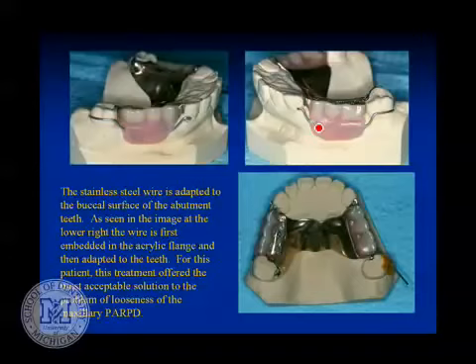So what we did was just add these clasps. It tightened things up for the patient, and she actually was very, very happy. It snugged it up significantly for her. She was happy with the amount of retention, and she was most happy with not having to have crown lengthening, ridge reduction here and crowns on the adjacent arch.